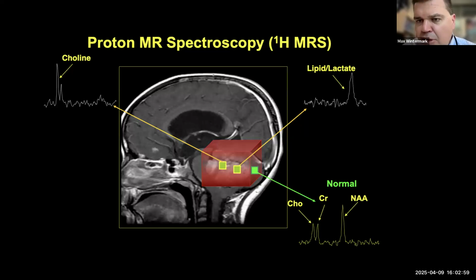What I'm telling you is, of course, a simplification. There are changes in that general rule I give you based on the age of the patient. As the brain of the pediatric patient is myelinating, these change. Also, it depends a little bit on the region of the brain, the basal ganglia, the hemispheric white matter. They have slightly different spectrum, but that's a good thing to remember.